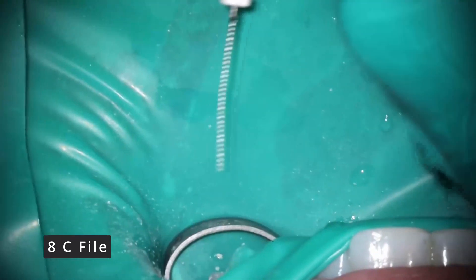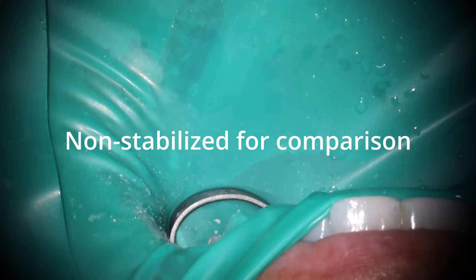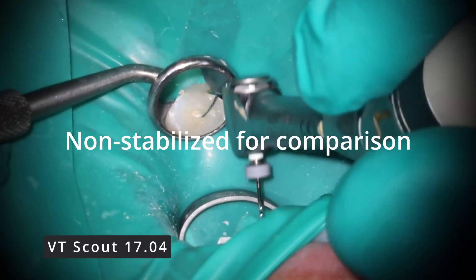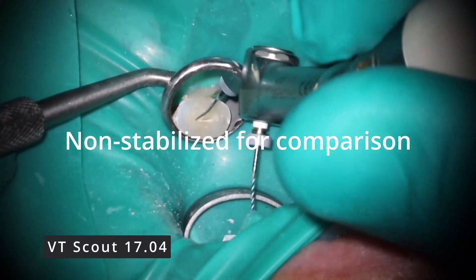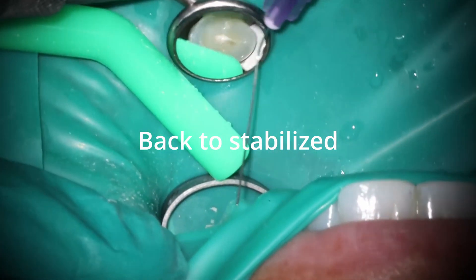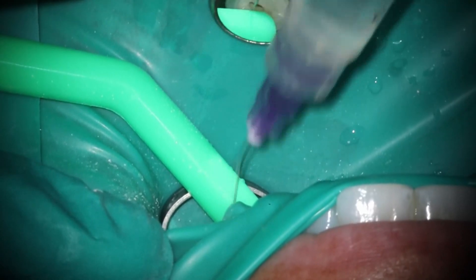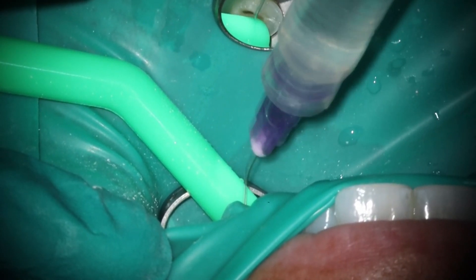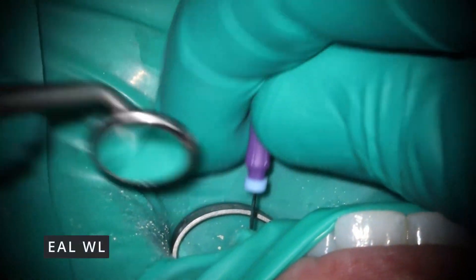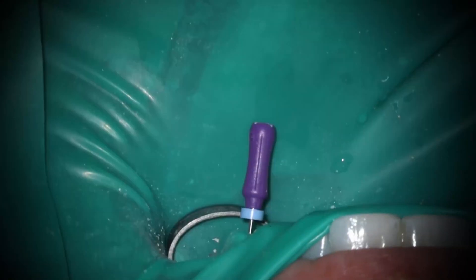This is endo uncut — the only cuts you see are to stabilize the footage so you don't get motion sick. It is a premolar done in under 10 minutes, so it can be very efficient even with a decent-sized curve. The 17/04 dropped beautifully to length with no issues whatsoever. The estimate was 21 and it ended up being 21. I drop it pretty much down to the stopper — about a millimeter and a half short — to adjust for what I took off the occlusion. Checking the working length took longer than anything else.